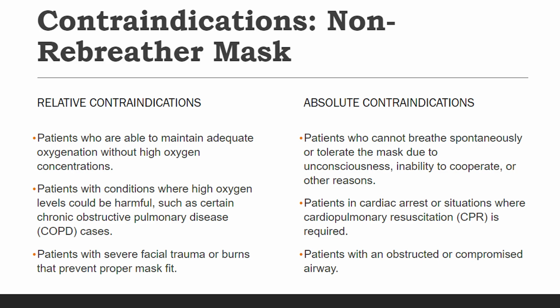Patients with conditions where high oxygen levels could be harmful, such as certain cases of chronic obstructive pulmonary disease, or COPD, require careful consideration. High oxygen levels can potentially worsen their condition. Patients with severe facial trauma or burns that prevent proper mask fit may not be suitable candidates for this mask, as a secure mask fit is essential for effective oxygen delivery.